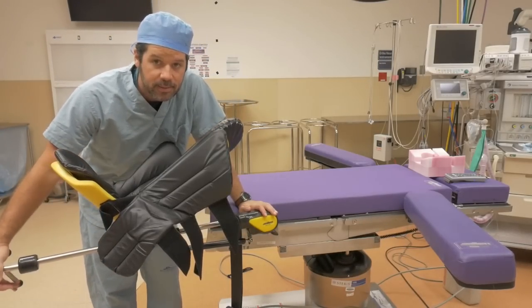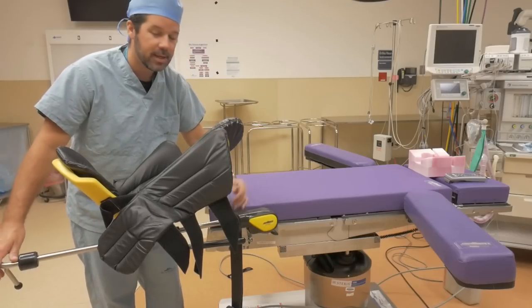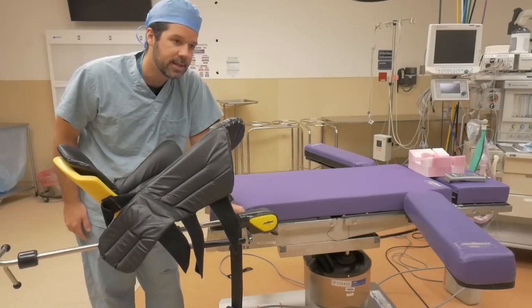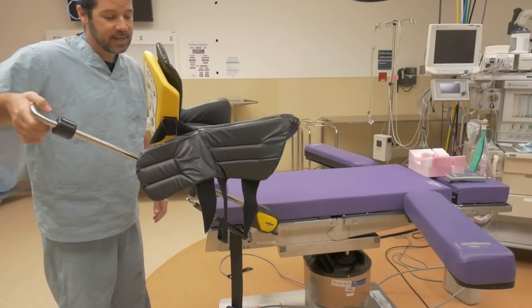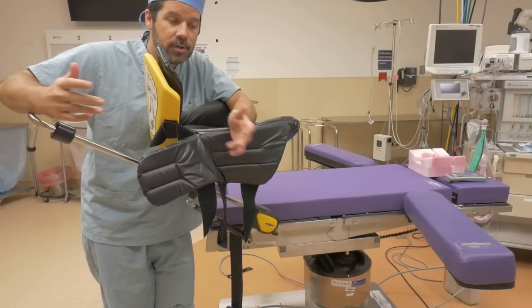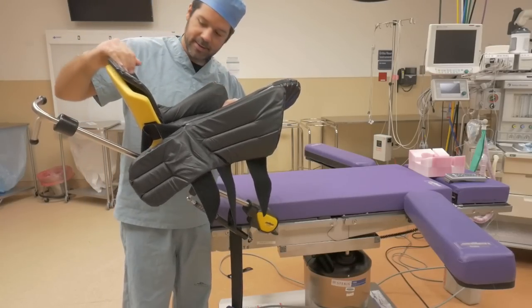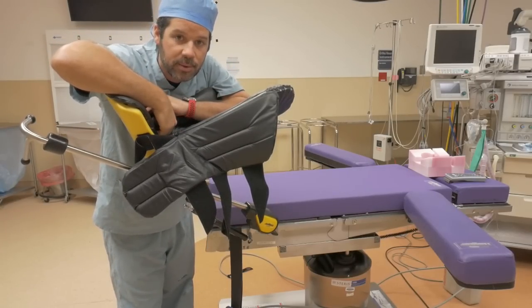The Allen stirrup is another device for the lithotomy position — the other one was the candy cane. It's basically doctor preference between the two. For bigger cases where you need to maneuver the leg more, the Allen stirrup works great. The candy cane — once you put the legs up, that's where they stay for the remainder of the case. But the Allen stirrups have a lot of padding and a lot more mobility.